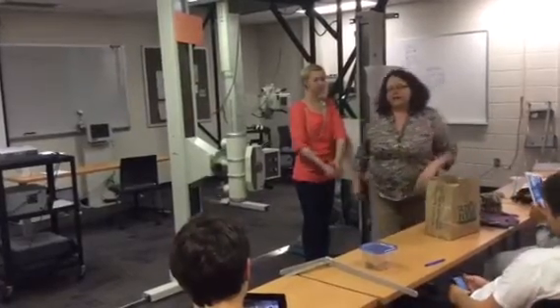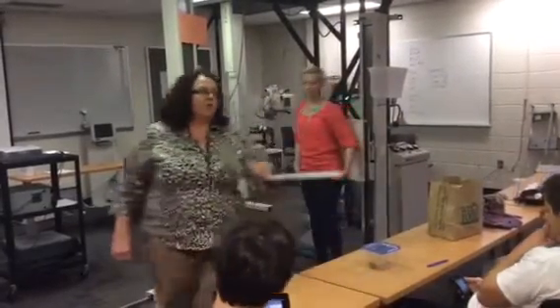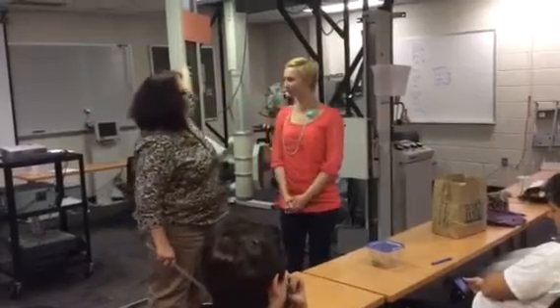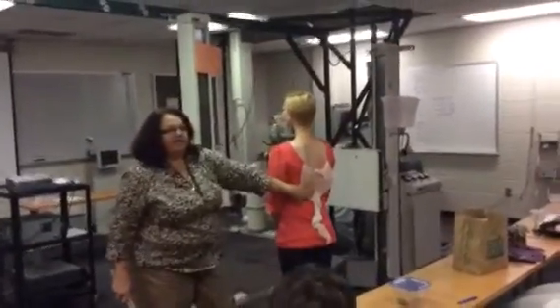The lumbar oblique. Let me show you how to measure for lumbar oblique. This is one of the things everybody gets wrong. The swimmers and lumbar oblique, everybody gets wrong. So, okay, turn facing that wall. We're going to find the spine.